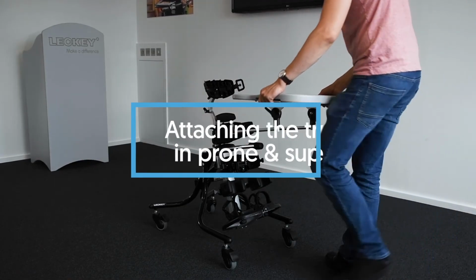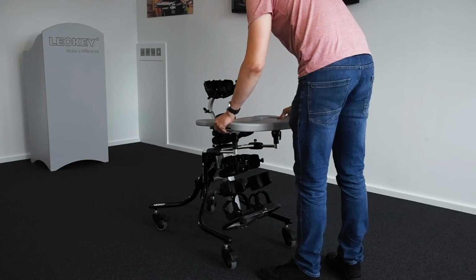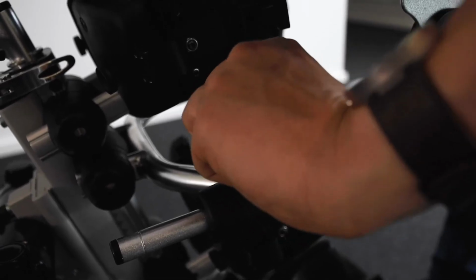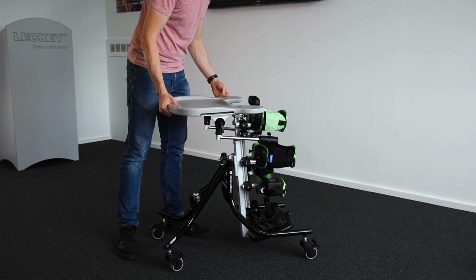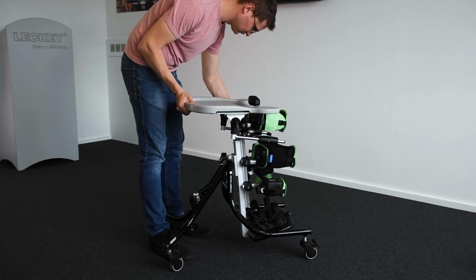Attaching the tray in prone and supine. The tray is attached to the stander by inserting the tubes into the receiving brackets. Once the tray is located in position, the knob should be tightened. The cutout of the tray should always be facing the child. To attach the tray whilst in the prone version, ensure that the tray receiving tubes are at their maximum height.